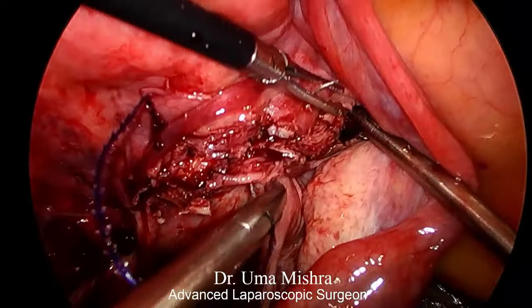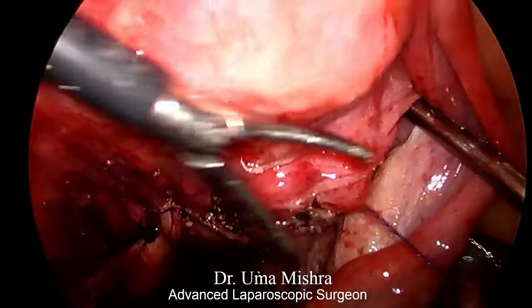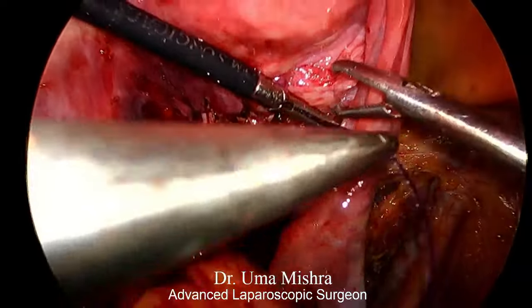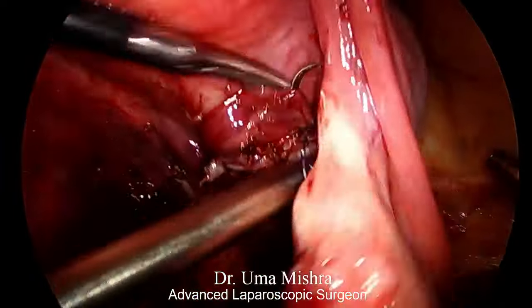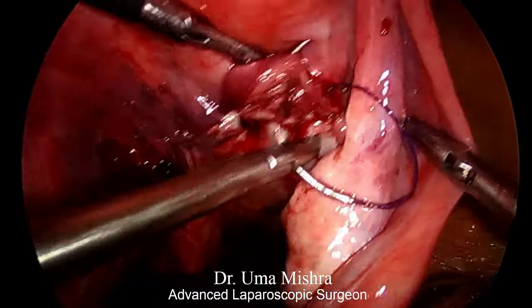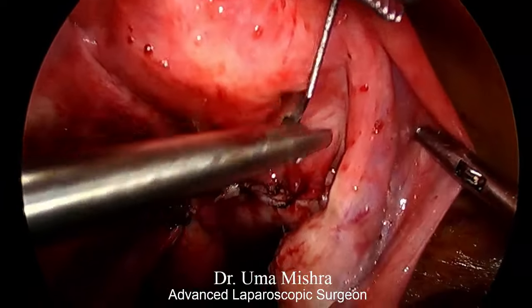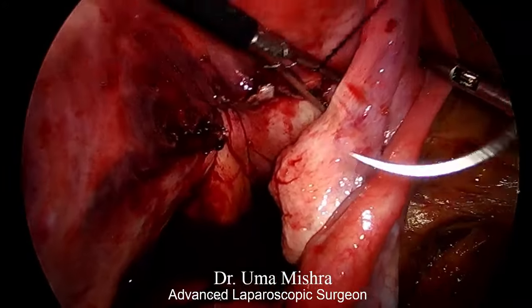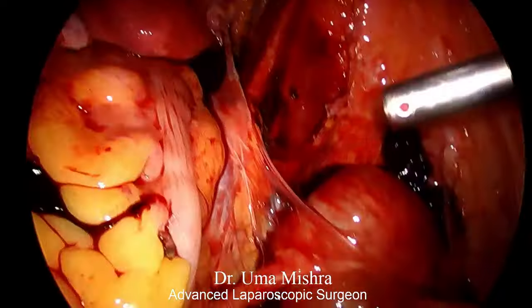So after taking the deeper layer, now the superficial layer is being taken and here you can see almost we have restored completely normal anatomy of uterus. So after suturing, we give a nice wash. We perform morcellation.